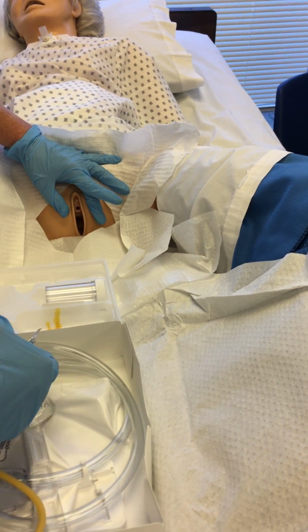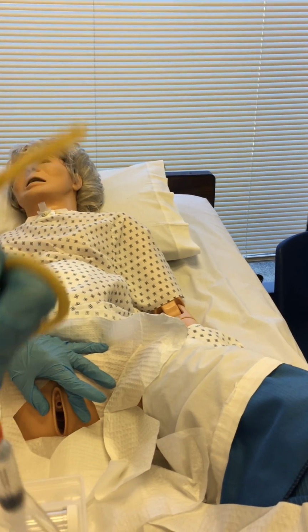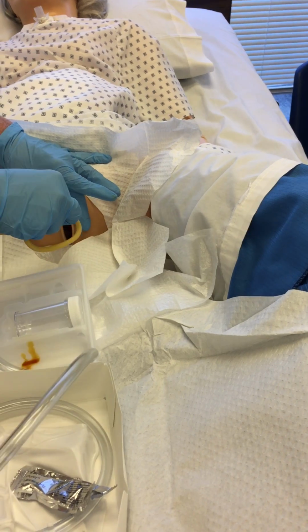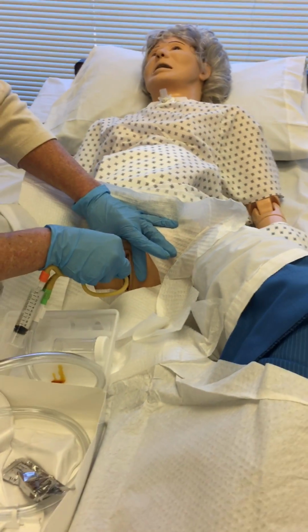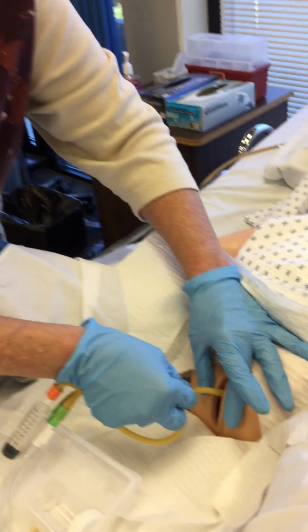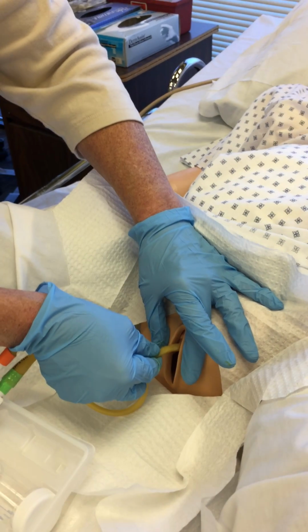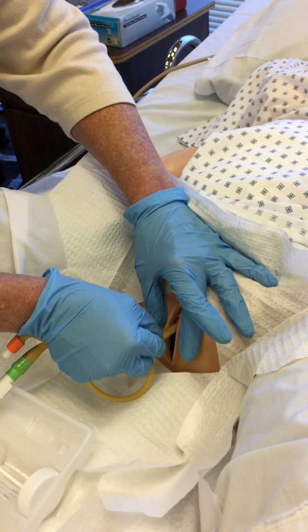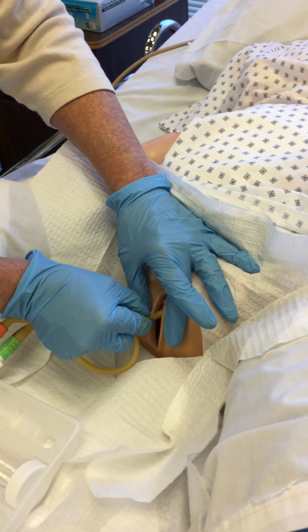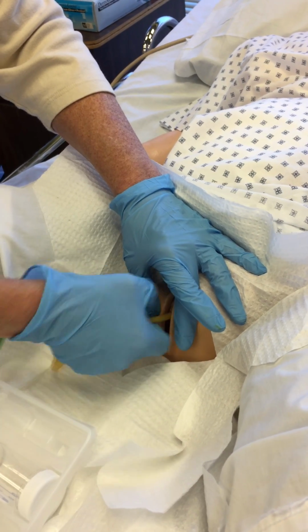Try to get that package off of there again. Coil this around, because like I said, it's like a sneaky snake. And we're going to advance into the urethra. Can you bear down just a little bit as I push this in? You might feel a little bit of pressure, a little bit of burning, okay, Ruth? And you advance your catheter in. There we go.